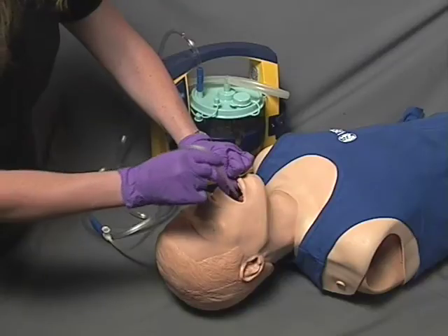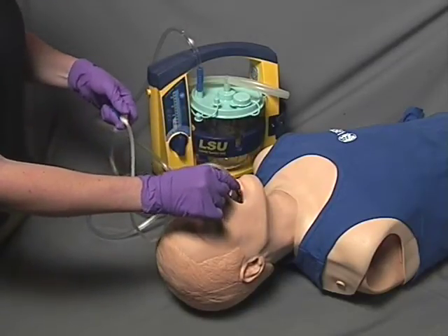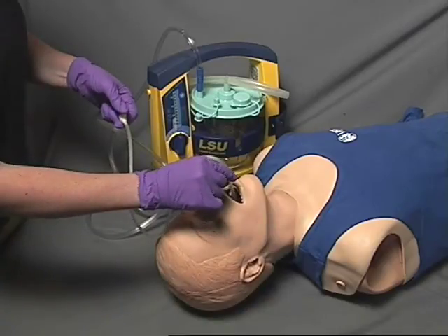Ensure there is no suction at the tip and insert the catheter into the oropharynx. Once inserted to the proper depth, apply suction at the tip and move the suction catheter around the oropharynx for a maximum of 15 seconds to suction the airway.